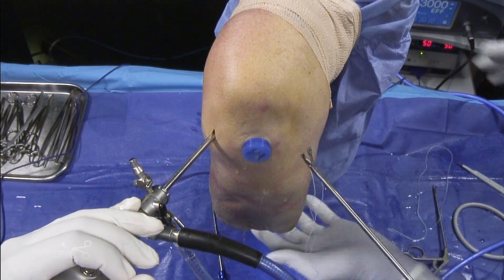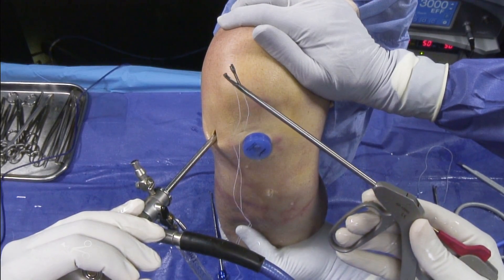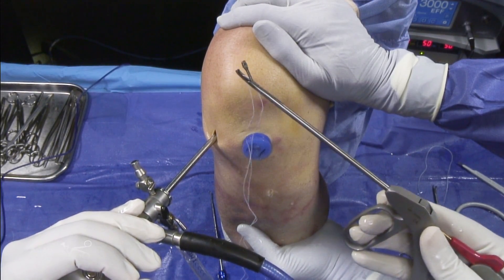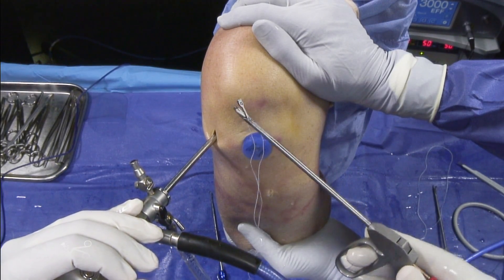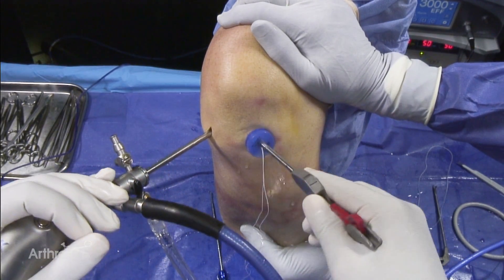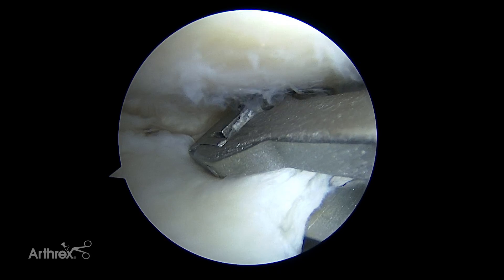Now we're going to place a second stitch anterior to the first one. We're going to take our O fiber wire and place the very center of it through our knee Scorpion. I'm going to go in and really create a loop in the back of the meniscus and grab this.